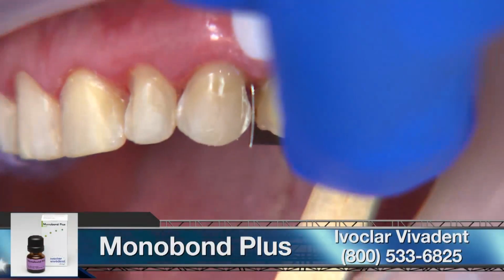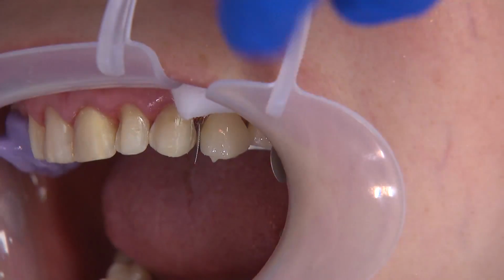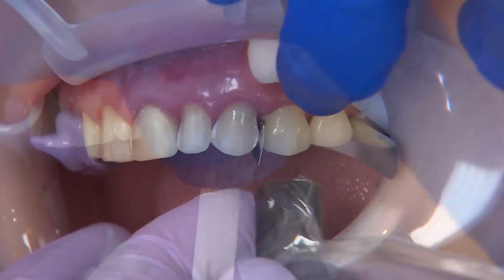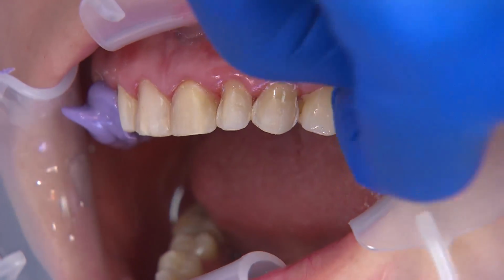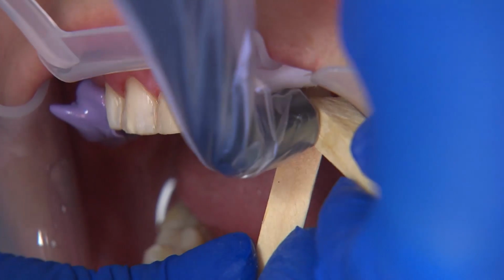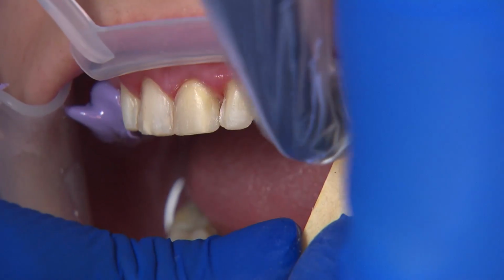In terms of isolation, I used cotton rolls and Mylar strips. The veneers were placed in 2 sets at a time and held into place using wooden sticks, applying light pressure on the facial and the incisal to ensure correct seating. For this case, I thought it was easier to bond the veneers in place starting with the posteriors to get them out of the way. Then I went back to the 2 centrals and worked my way towards the cuspids.